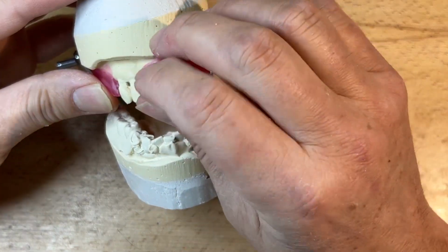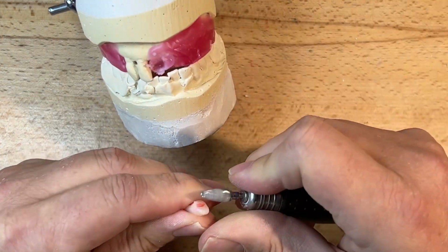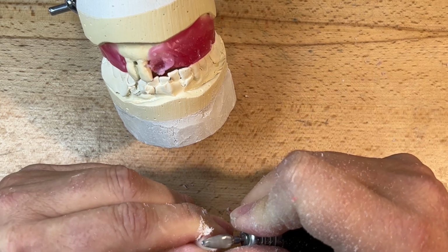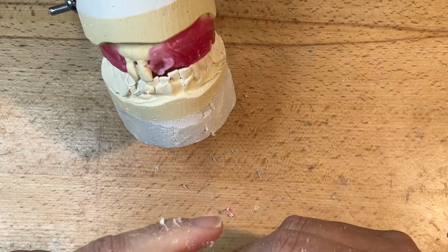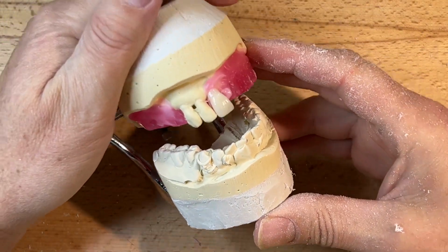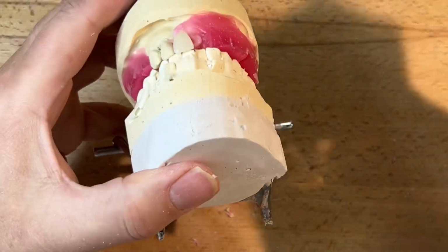And I've chosen the mold off screen here that'll best suit the characteristics and the width and the length of the existing two teeth. I've just got to do some grinding of the denture teeth to get the neck in, to get the correct emergence angle, to match the same emergence angle of the existing. And then I'm going to look at the occlusion here.